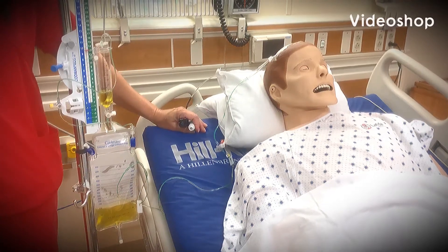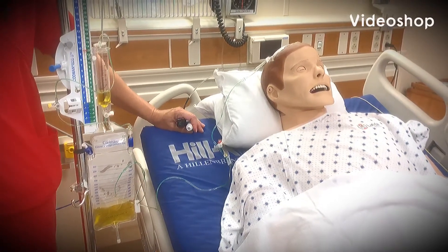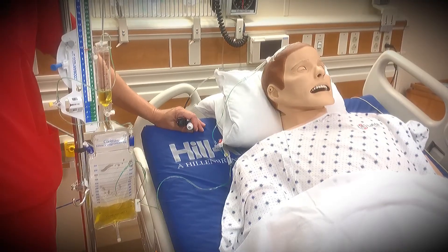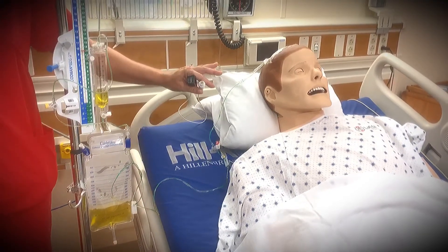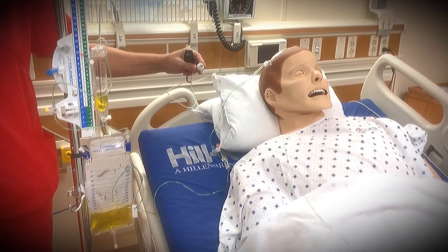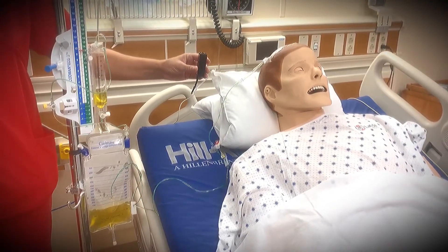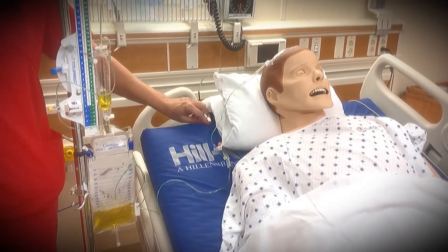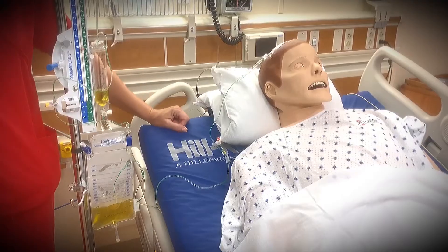In this video, we are going to be assessing a patient with an external ventriculostomy drain device in place, or EVD. The cables I have here in my hand are just additional cables for additional measurements — temperature, and this one can measure ICP or intracranial pressure. But today we're going to focus on the assessment and management of the EVD system.